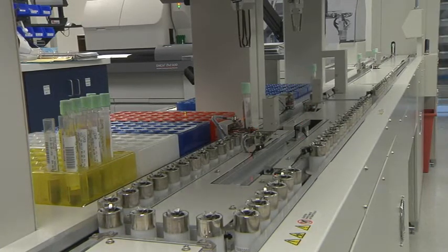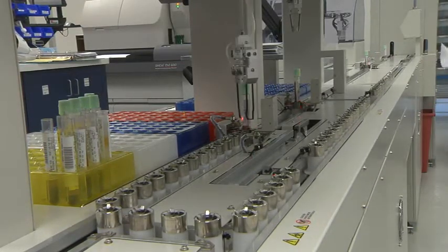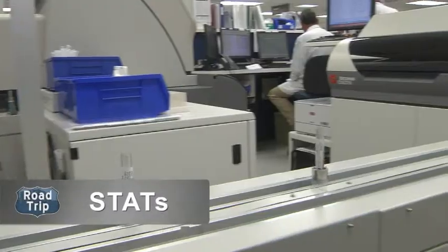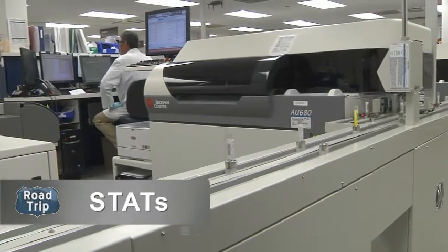And we try to keep a continuous flow on the line so that we get the best throughput. So we have learned which ones to ask to go next or first so that we don't overload the line with samples. Our stats and our urgents and our time specimens from all departments are labeled with a yellow label so we can see which ones need to be put on the line first or put into the stat rack, and we use those on the power processor in the red rack and process them that way for unspun samples.